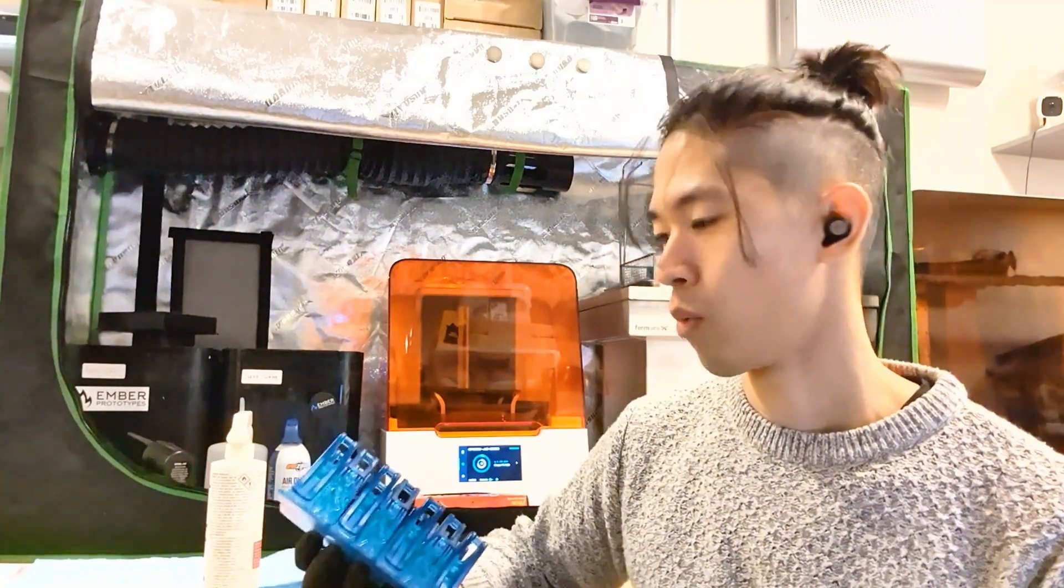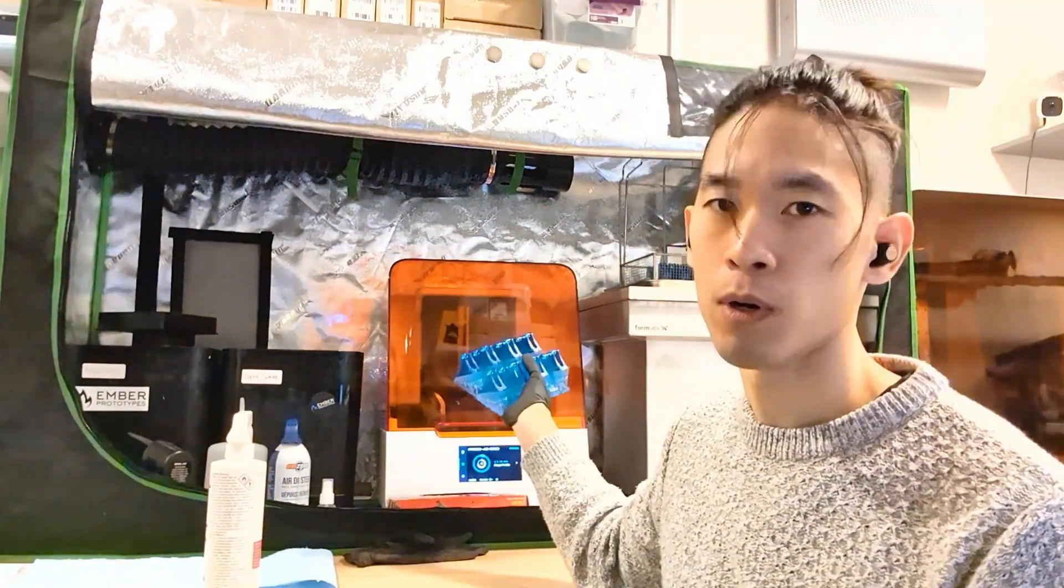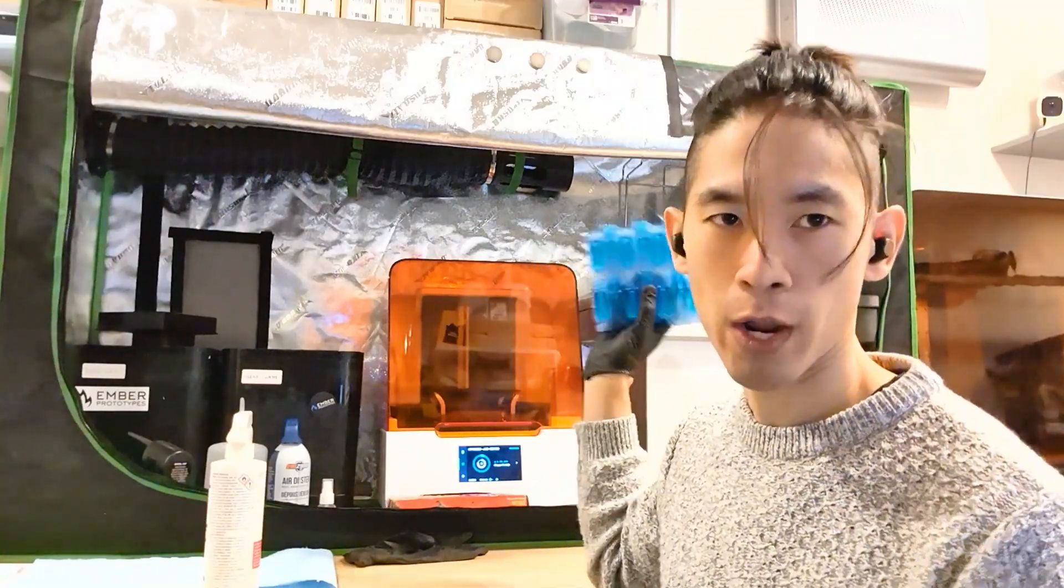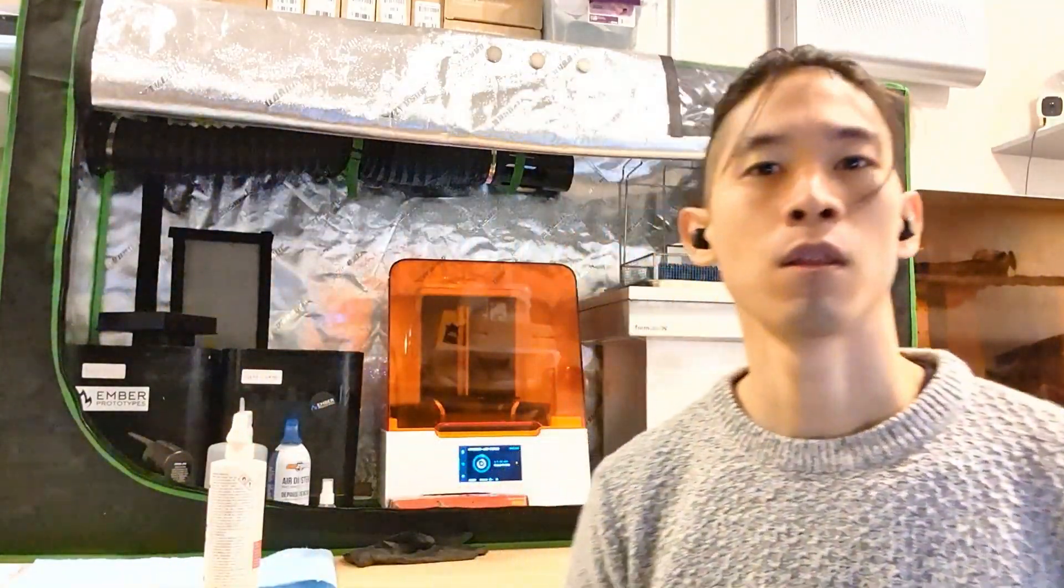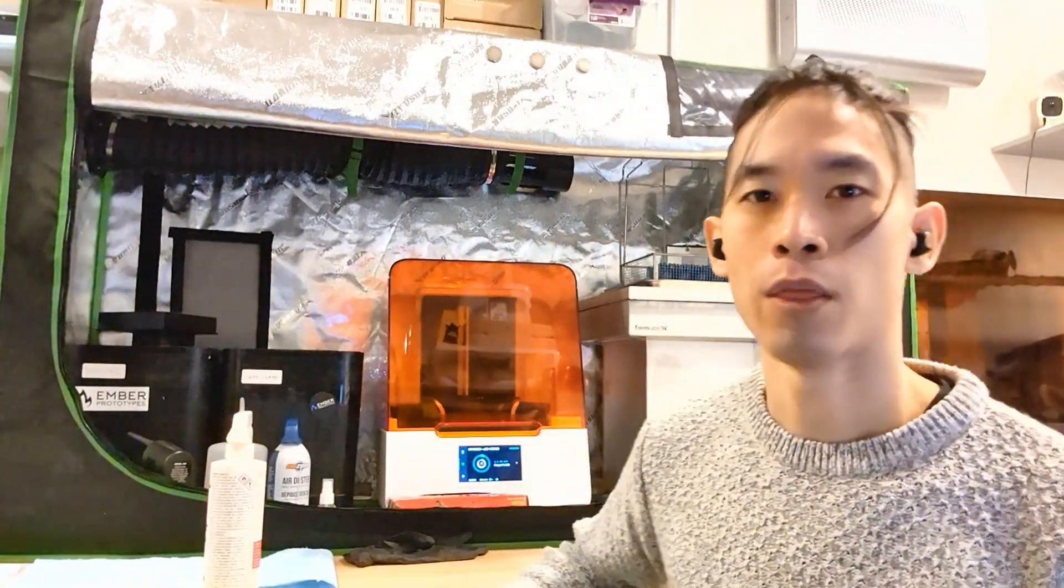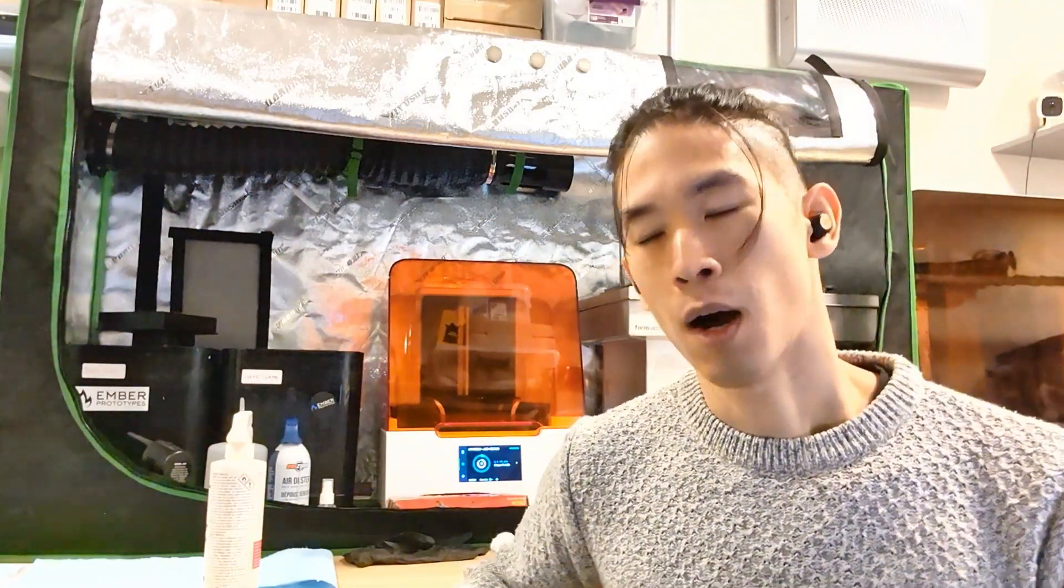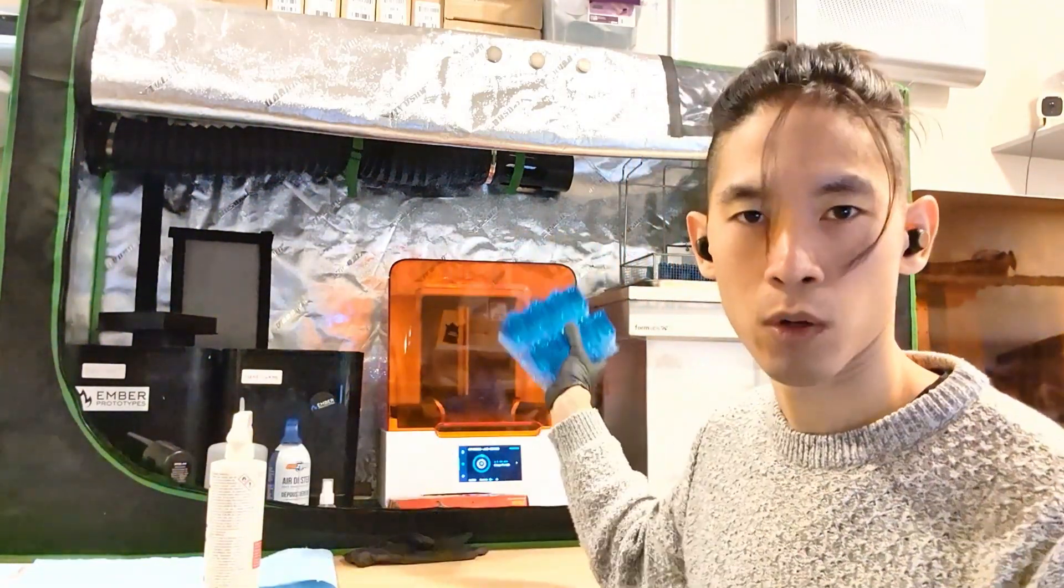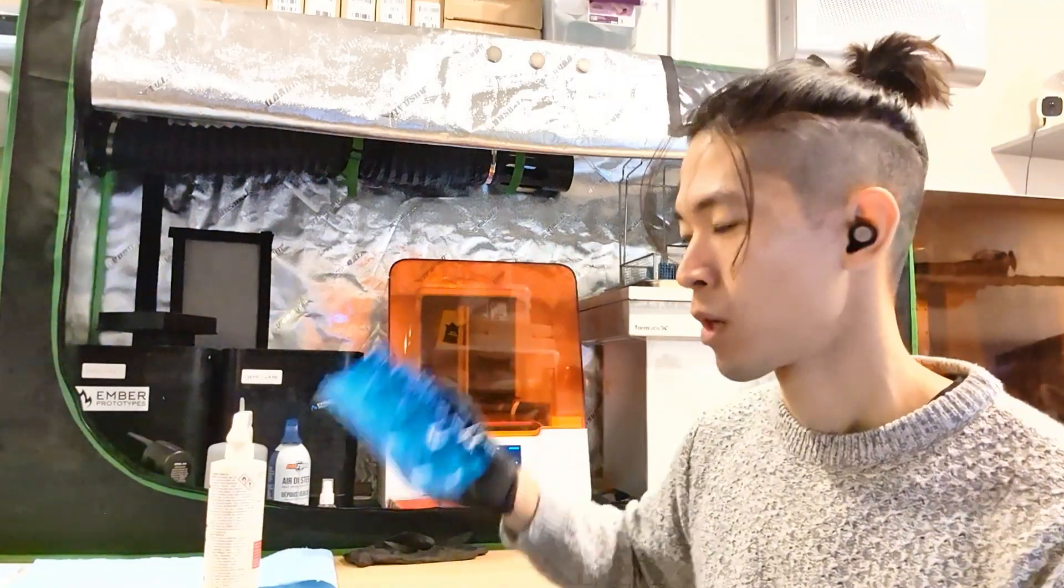Now, we only have one Form 3B, but we've got the 3L, which you see over there, which is the big boy, and then we have another Form 3. But for bio-med applications, we can only print on this guy.